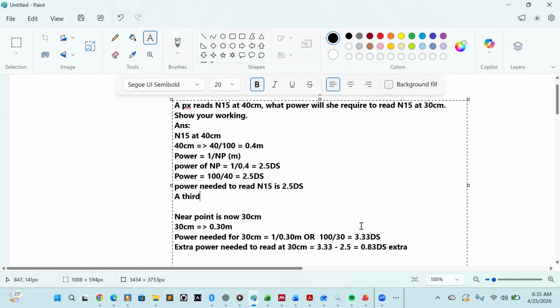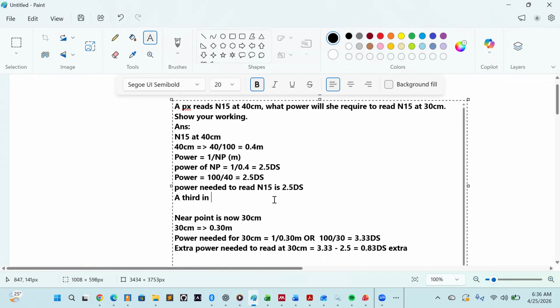If it's a full, complete question, you have to actually do the reserve, because what happens is that you have to keep some power in reserve. You can't use everything, or the patient will have headaches. I told you about accommodation and everything. So the patient will have headaches if you give the full power without keeping some in reserve, because it's difficult to measure the exact amplitude when you are testing, so you have to account for the variability. So keep a third in reserve here.